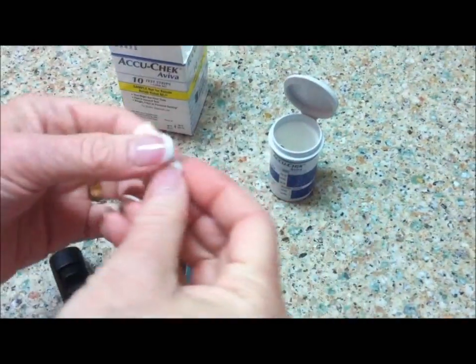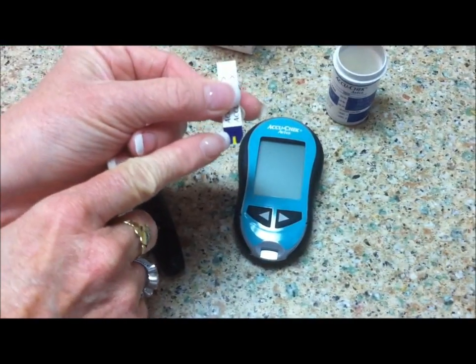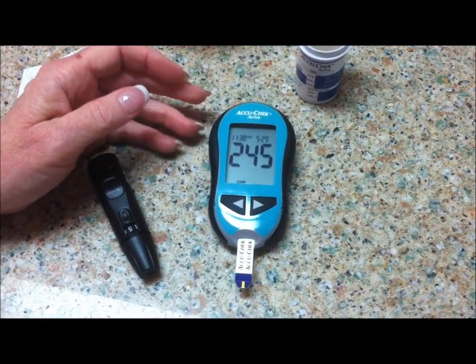The strips are a little bit larger, so they're easy to handle. This gold tip goes into the meter, and the blood goes into the blue end. You put the strip in all the way and the meter will wake up.